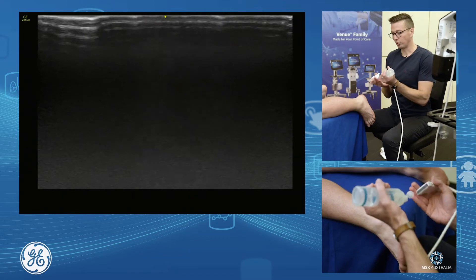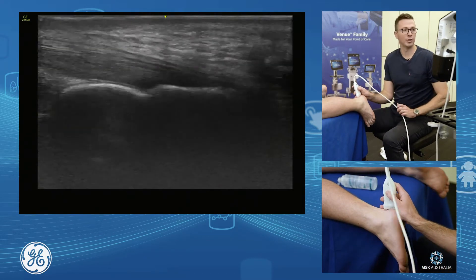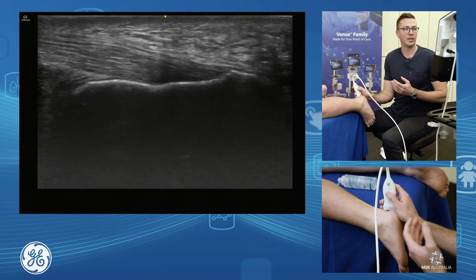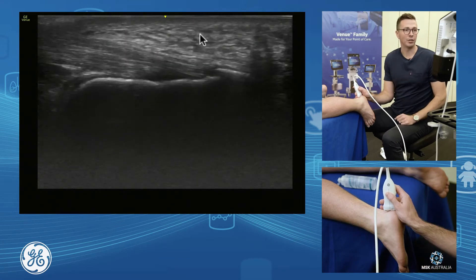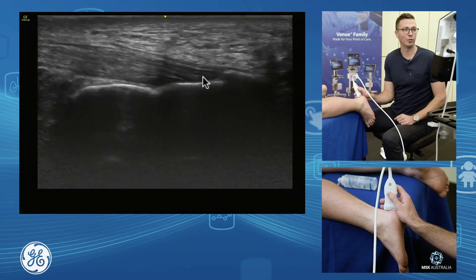We can assess the tendon in short axis and also in long axis. The tendon can have active enthesiopathy — your spurs, your enthesophytes at its insertion. So we assess the insertion foot plate.